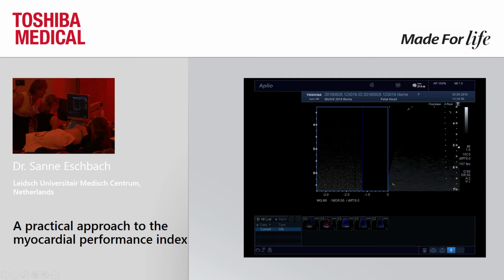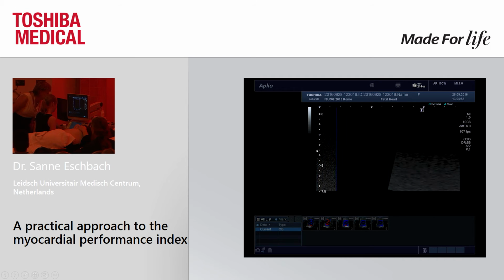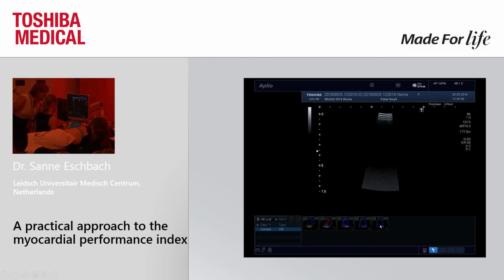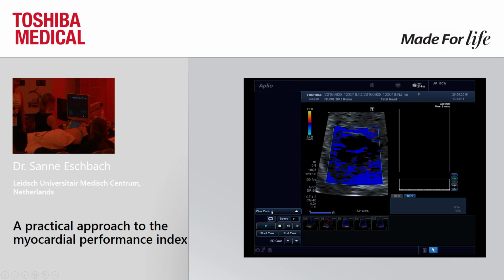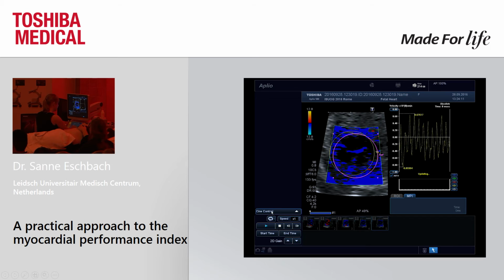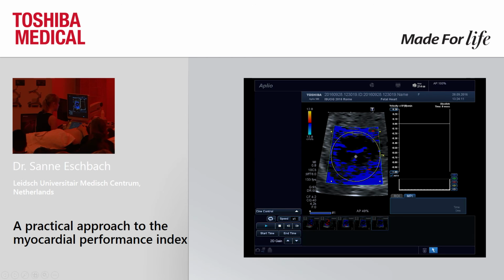So let's see on a clip we just made. From here, we are going to check the MPI again. Then we have even more seconds and even more cardiac cycles, and you can see the movement of the baby. You saw it when I made the clips, but you can also see it in the image here that it's drifting a little bit. But for the time intervals, it really doesn't matter as long as we find a good cycle to do our measurements on.